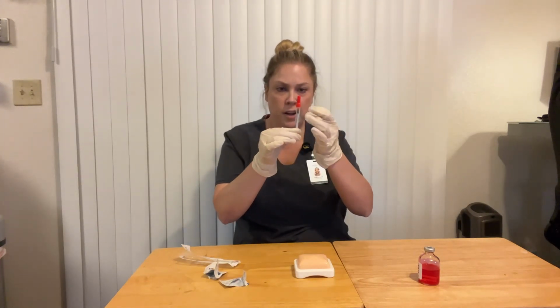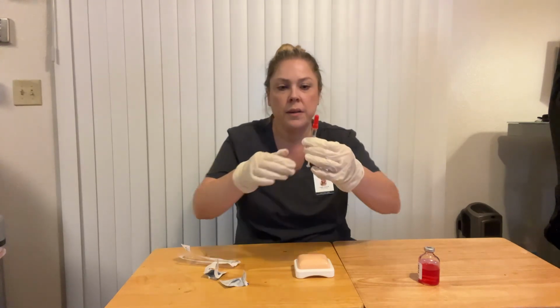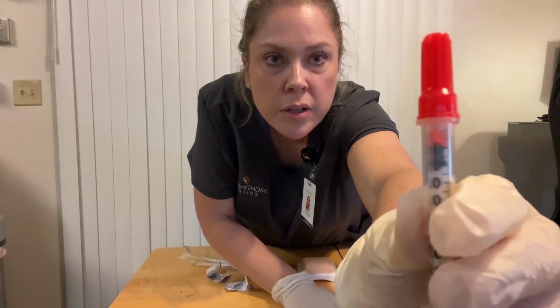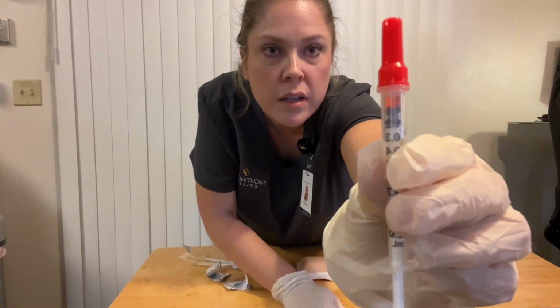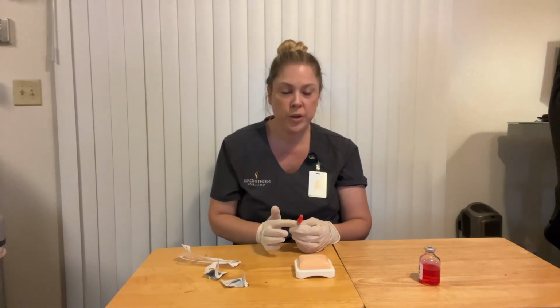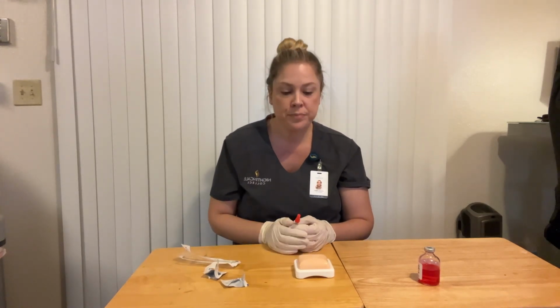Tap to get rid of any air bubbles. And that is 0.1. You can see that. Okay. I have my vial recapped. If I prepared this elsewhere, I would make sure I labeled the medication with the correct medication and dose on here before I took it to the patient.